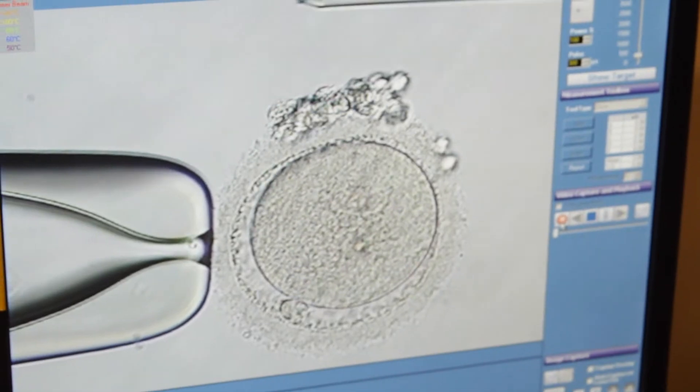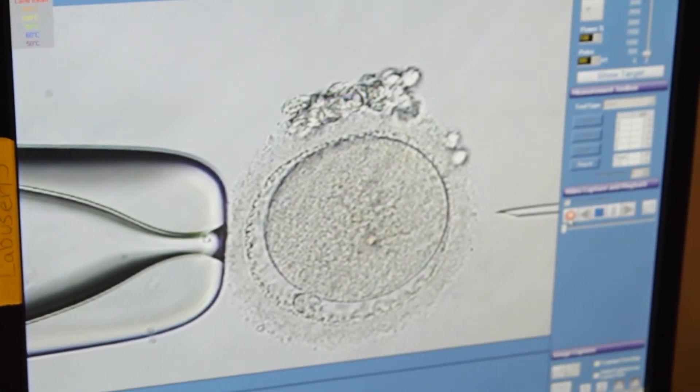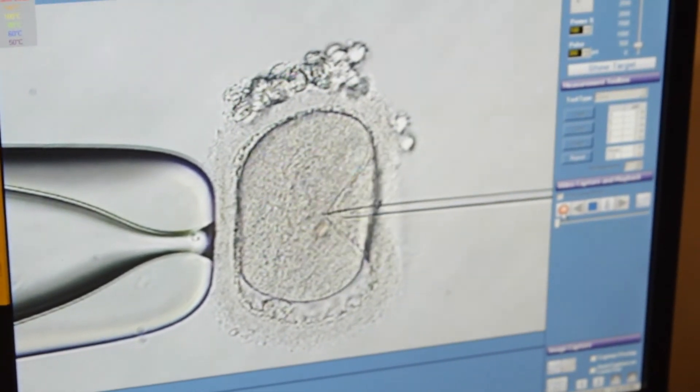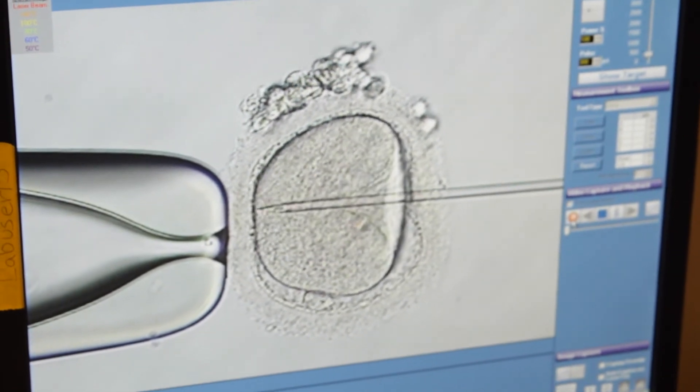Now what Donna is doing is bringing that sperm down to the very tip of the injection pipette. The idea of doing that is that we want to have no extra PVP injected into the egg.